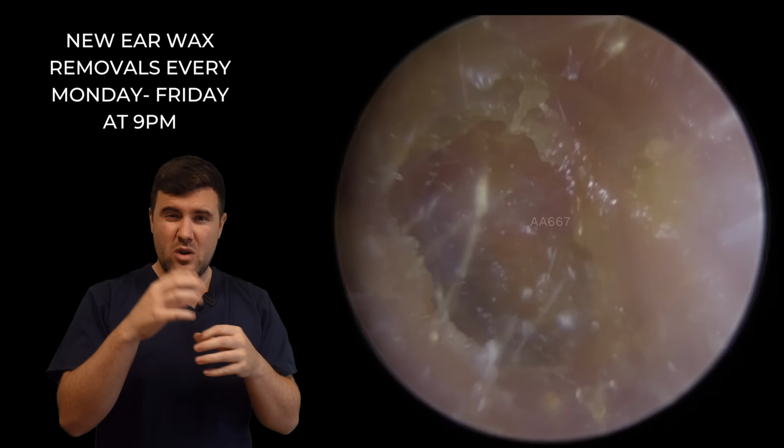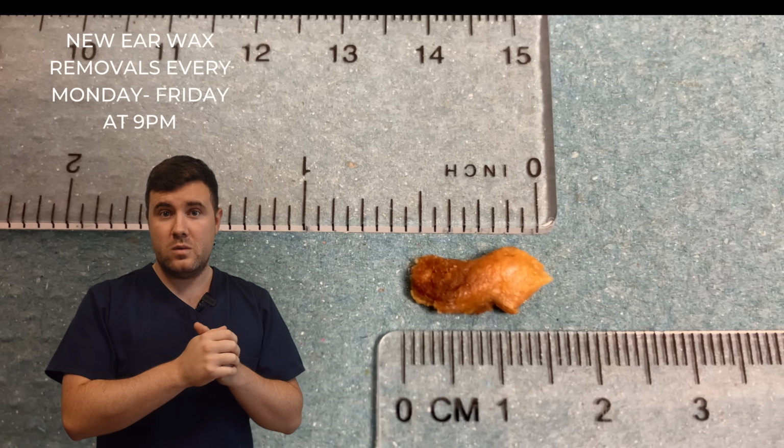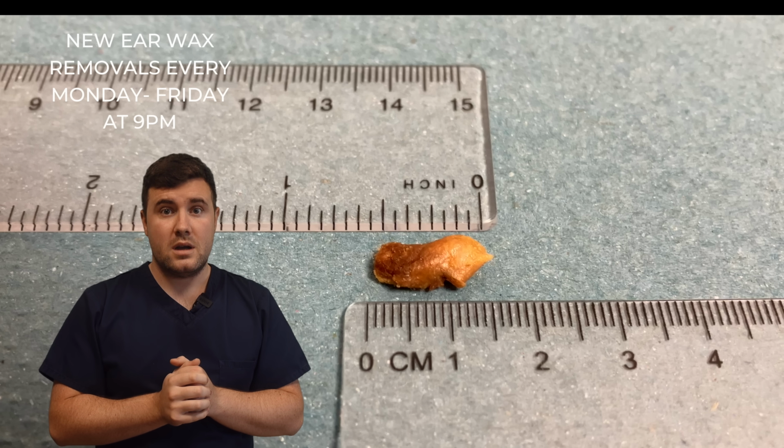And you can see the eardrum looking a little bit aggravated, but I think this plug's been there for quite a while, so it's affected the appearance of the eardrum. And there we go. We've got just over half an inch, about 1.5 centimeters, of a wax plug there.